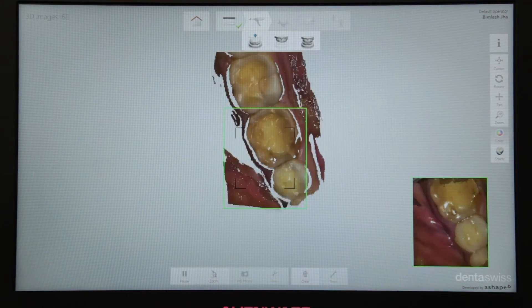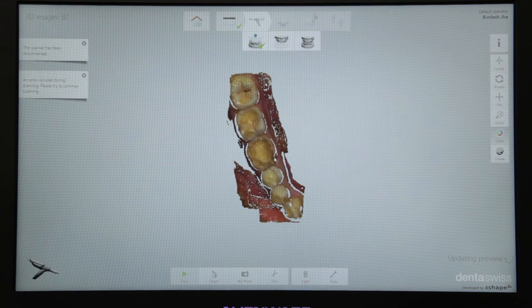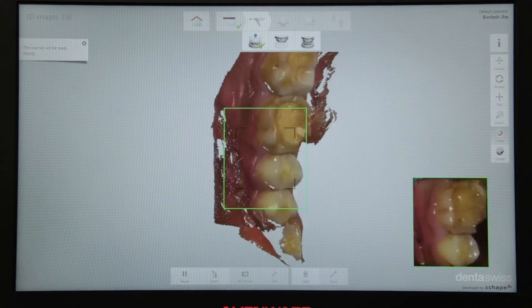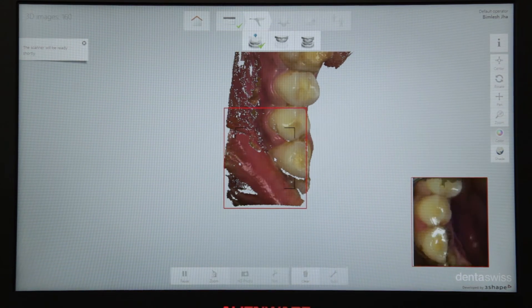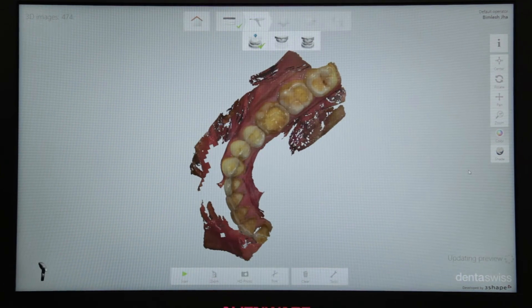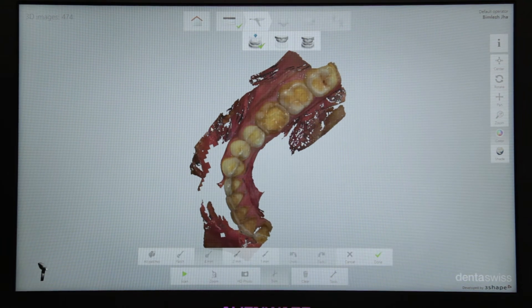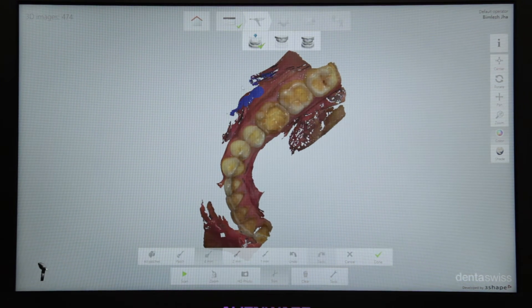You can see how quick it is. In case you see any voids, all you need to do is just start scanning from that particular area — you need not repeat the entire scan. You see how cleanly it stitches everything together. You also have an option of trimming away all the unnecessary soft tissue that might be recorded during the scan.